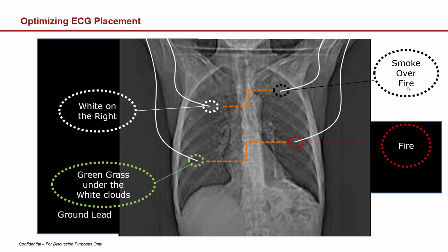The idea here is that if your X-ray beam is shooting through here and you have two metallic objects on the same plane, there's going to be information loss between those. But if we offset these, then we won't actually have any beam hardening in between these areas. That could be helpful if you're trying to evaluate mammary arteries for a graft selection. So best practice is always offset these a little bit and place your leads on the thoracic chest wall, so right there on the rib cage.